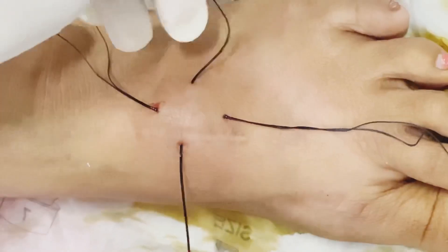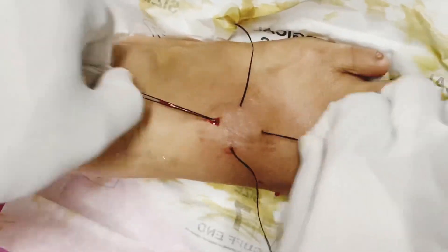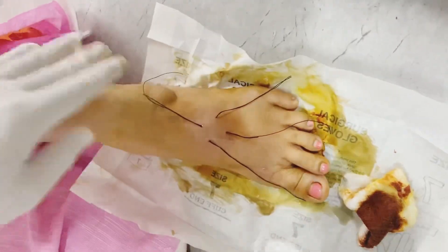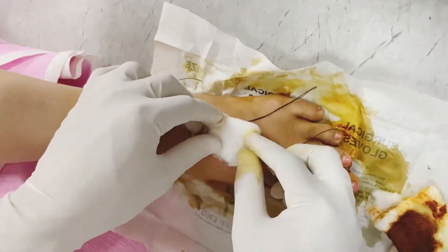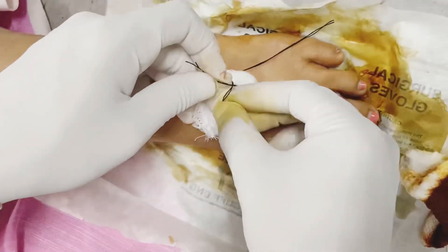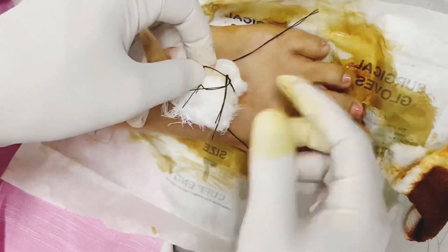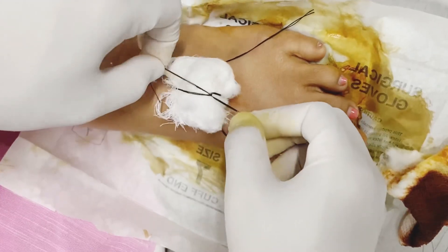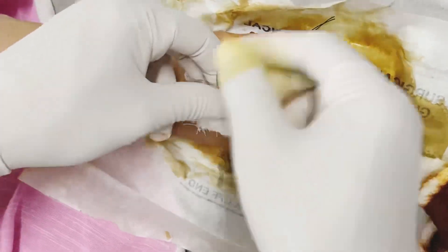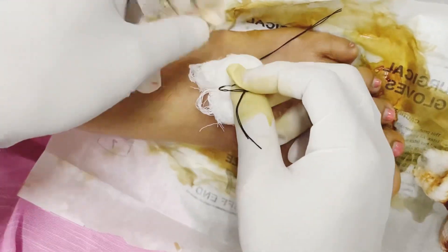After completely emptying the cyst of its contents, a sterile gauze piece is placed over the ganglion and the thread is tied over it making a single loop. A pressure bandage can be applied. We will call her after one week for follow-up.